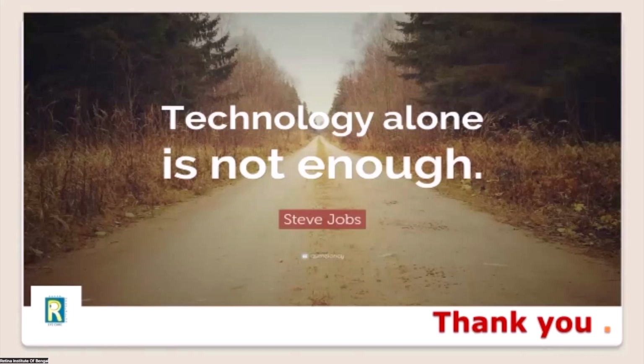Finally, technology alone is not enough. It's the doctor, the clinician, who has to take the last call of diagnosing glaucoma.